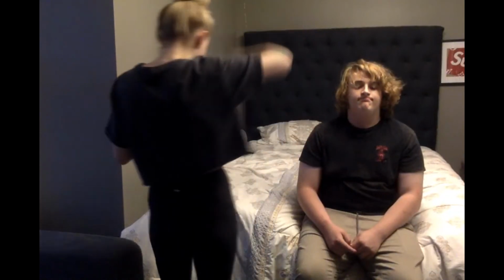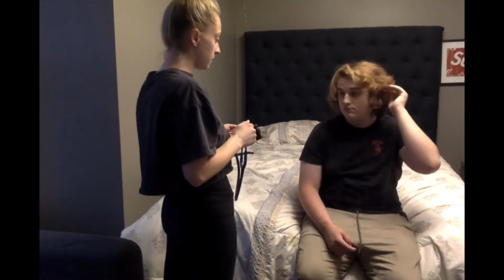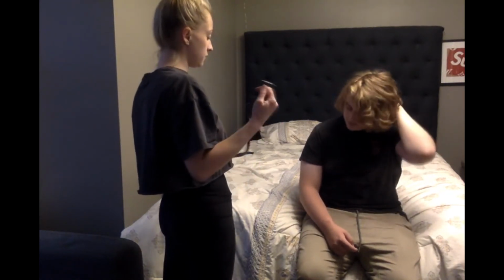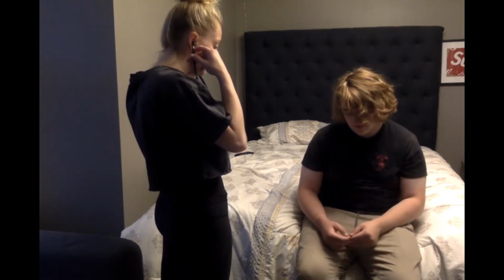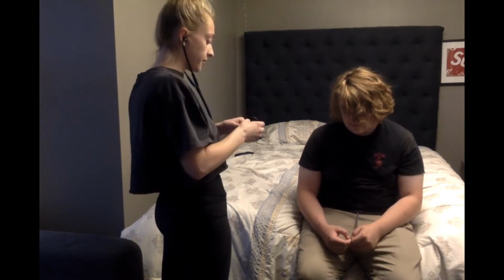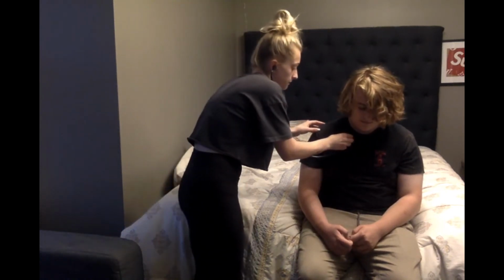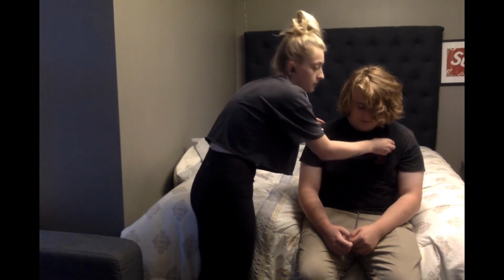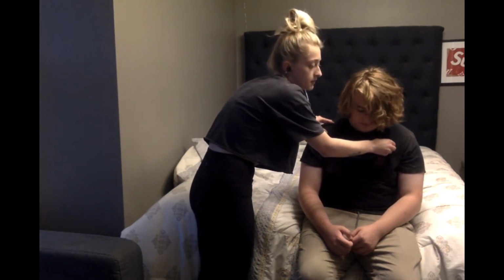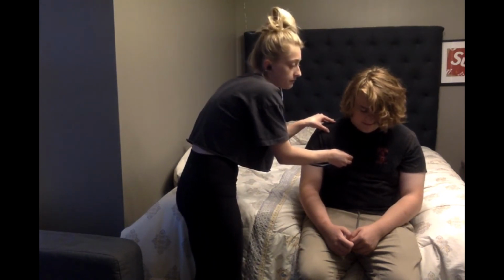Okay, next we're going to auscultate and listen to your lungs. When you feel the stethoscope, if you could just breathe in, and just let me know if you are having a hard time breathing at all or get dizzy, okay? So we're going to use the diaphragm, and we're going to do 6 sides, both anteriorly and posteriorly.